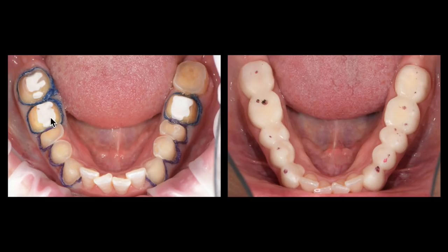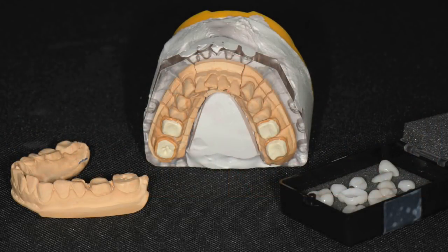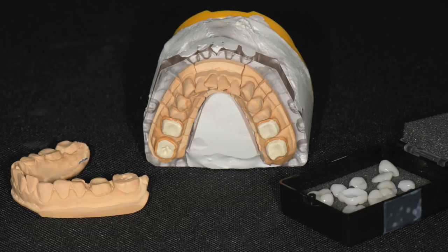These were both jacket crowns because one had endodontic treatment and one had a quite big deep previous restoration plus decay and a distal fracture, so we decided to treat that tooth with a full coverage crown. Here are the final restorations for the lower arch. I complete cases one arch at a time — in this case, I completed the lower restorations first. Then we tested the lower arch against the upper provisionals, which didn't take long because she was pretty adaptive, and finished the upper restorations a month later.